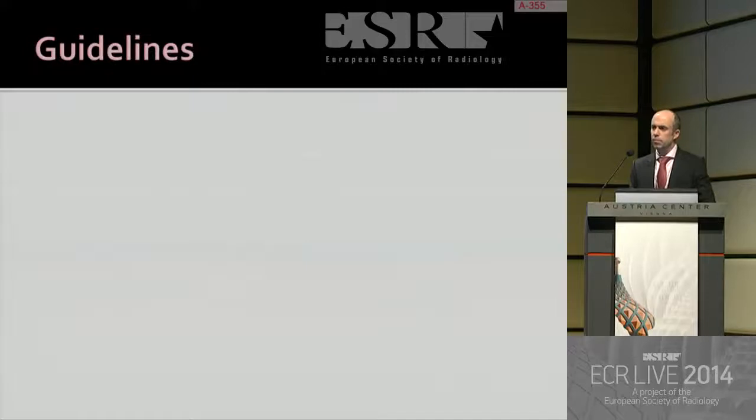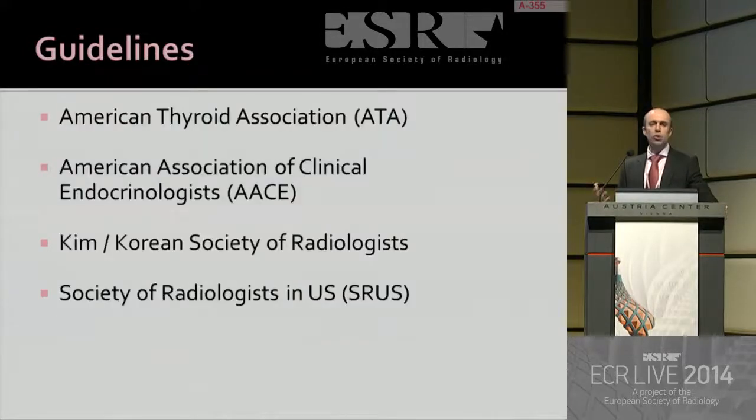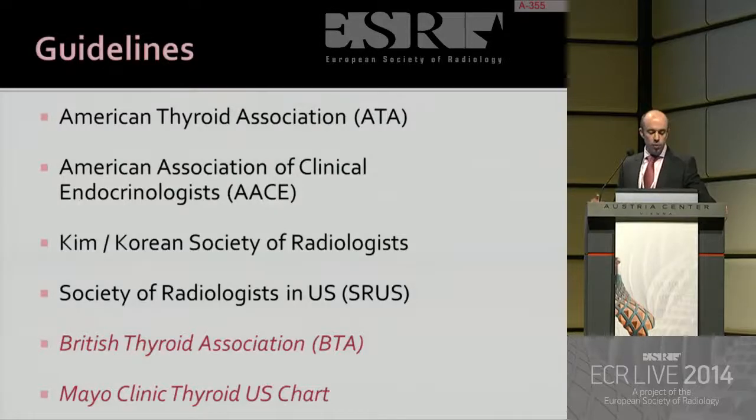So, guidelines. There are a host of guidelines internationally which we can choose to look at for the management and biopsy of thyroid nodules and follow up thereafter. In a different colour at the bottom, I've highlighted the British Thyroid Association and the Mayo Clinic Thyroid Ultrasound chart.